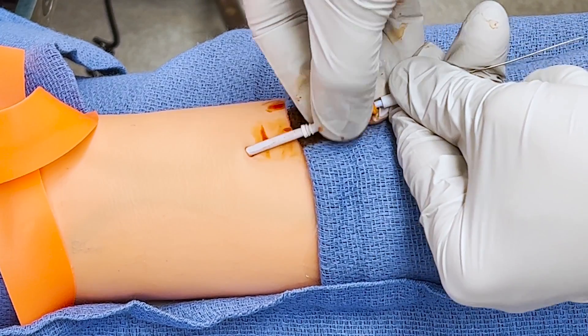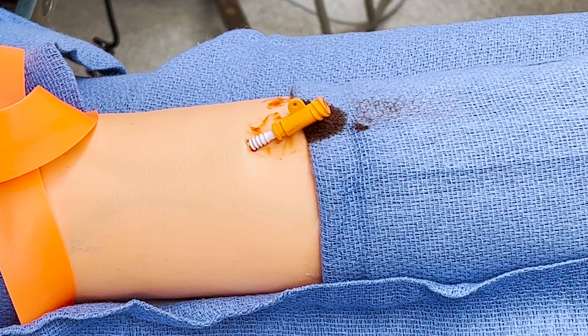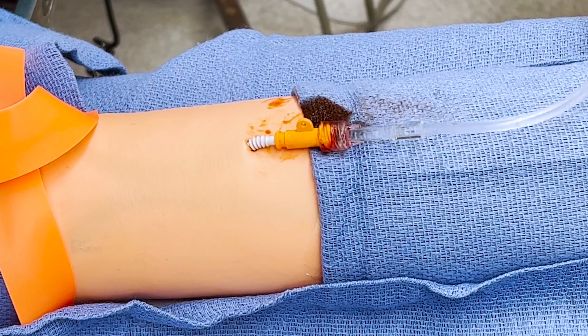Slide the catheter off the dilator the rest of the way into the vessel. Remove the dilator and wire. Attach IV tubing. Stitch the catheter in if desired and cover with a dressing.